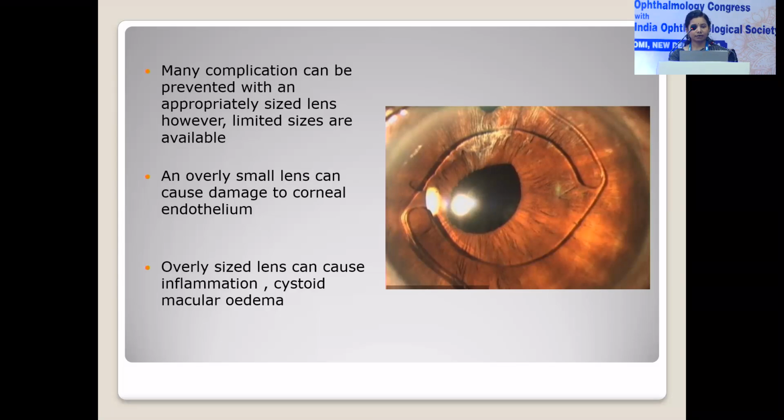So in cases of corneal endothelial disease, in cases where there is no iris support, or where there are angle abnormalities, these lenses are usually contraindicated.